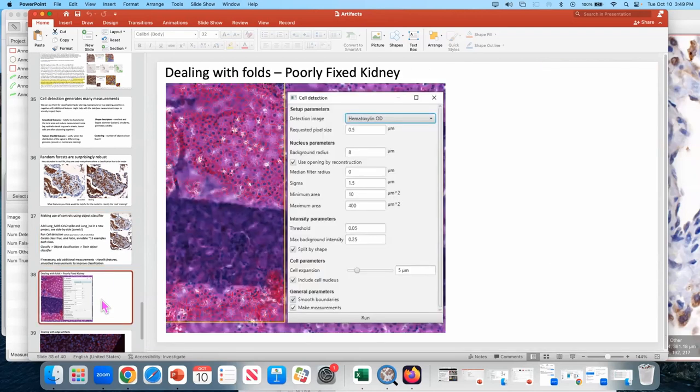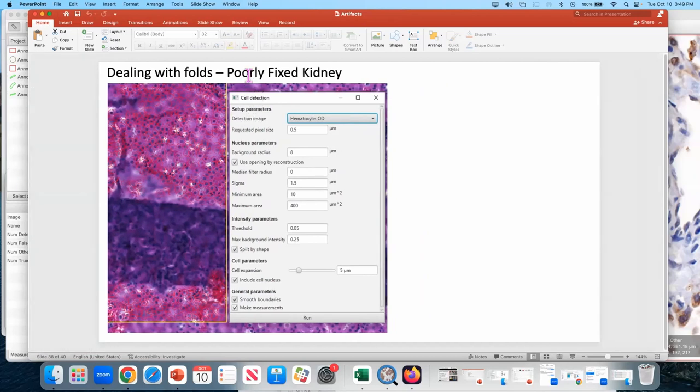The next common artifact that we have to deal with is folds in the tissue. So go ahead and open the poorly fixed kidney sample. Do a cell detection over an area that has a prominent fold. And in the interest of time, you can copy the parameters from here. I'm not 100% sure actually if I used the default stain separation settings or not. You can quickly go and do it, and I will do it as well.